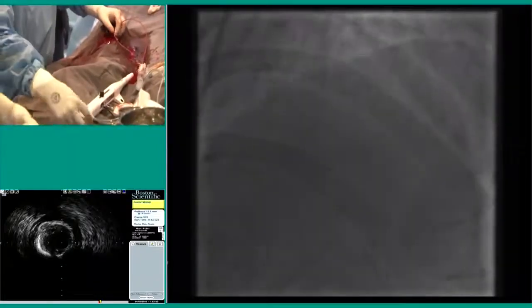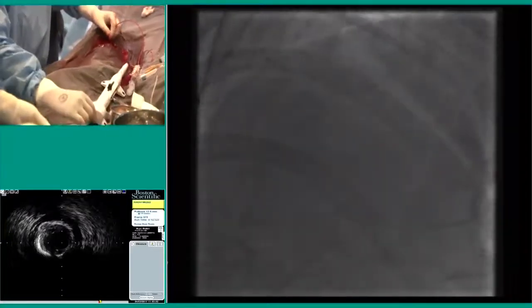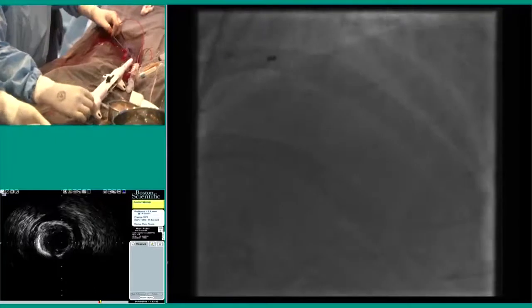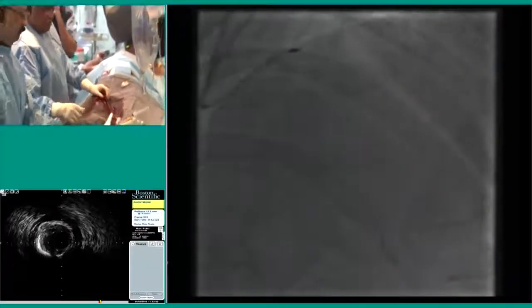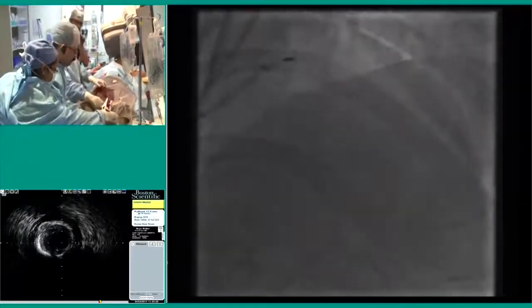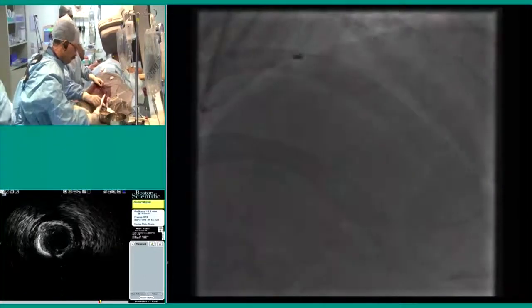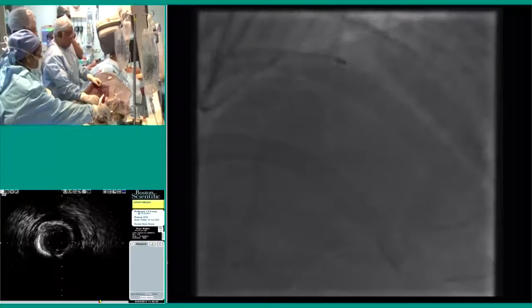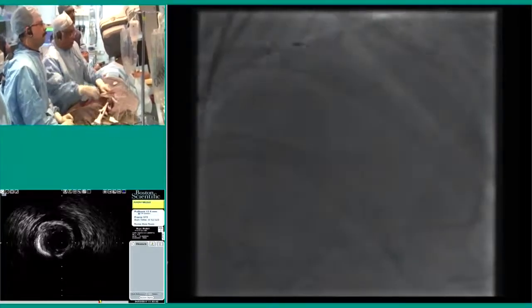And those who get used to this, it's far more predictable because you're only relying on yourself. Otherwise, if you're relying on someone else to push it in or pull it in, you suddenly have the wire coming out. And this is so much faster. Is this 1.25 burr? Okay, we are all set. 1.5. I finished. Now what we do is keep checking in between.